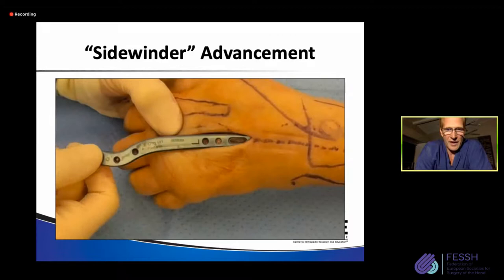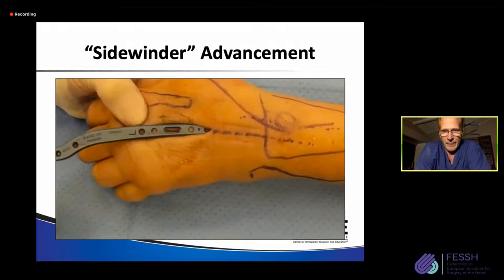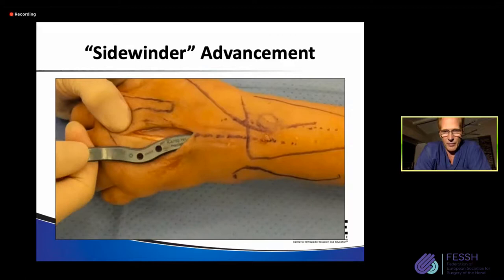So here's how it gets passed. You run right along the metacarpal, and it's very easy passing right to the fourth dorsal compartment here. But then you have to turn it. So right here, it's very easy. And then we turn when it gets to that point for the axis of the radius.